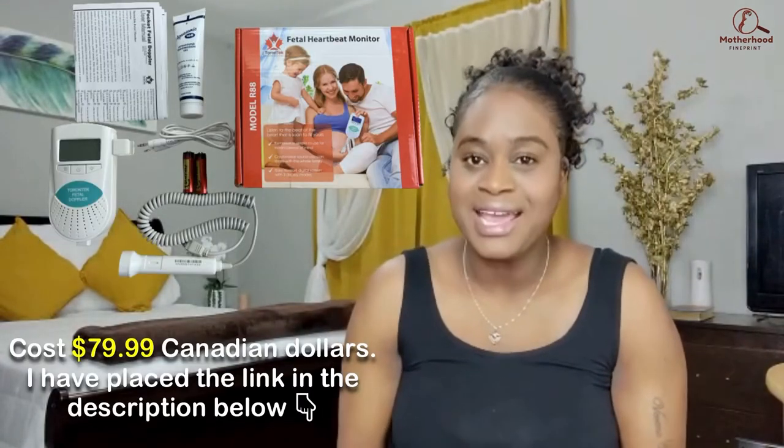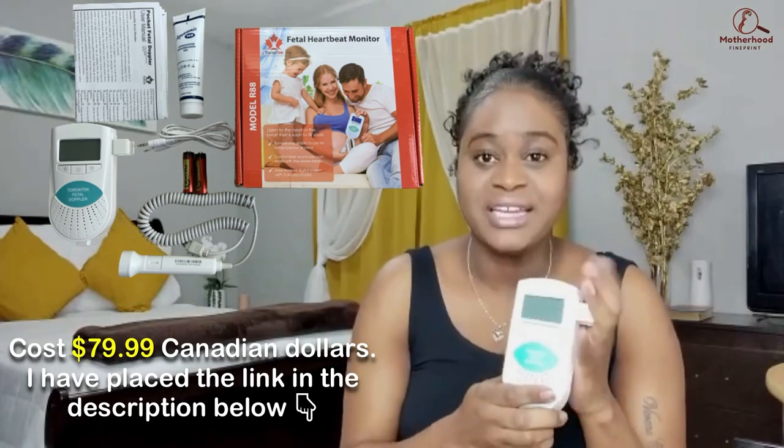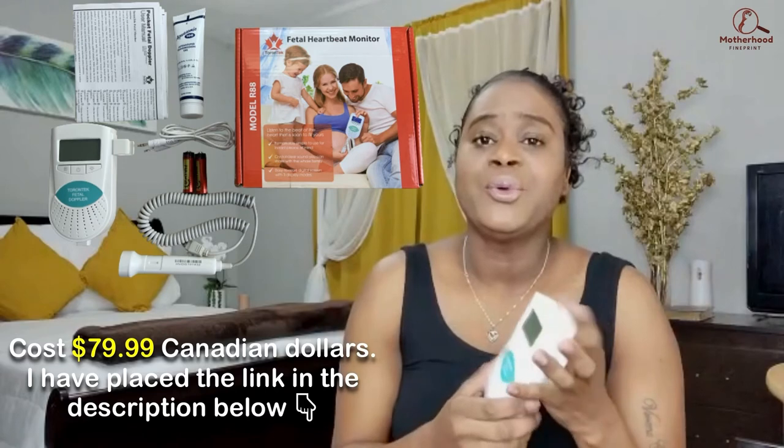As for whether it was worth the buy — absolutely. If you are anxious during your pregnancy like I was, this helped me have peace of mind and relax. That said, you have to be careful to position the probe correctly, or else you won't hear your baby's heartbeat, which could cause added anxiety. I suggest watching where your doctor places the probe at your appointment and repeating that at home — that's what I did and it worked every time. If for any reason you're not hearing your baby's heartbeat, do not hesitate to contact your doctor or go to the emergency room. It is always best to be safe than sorry.